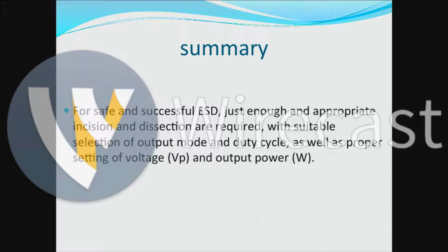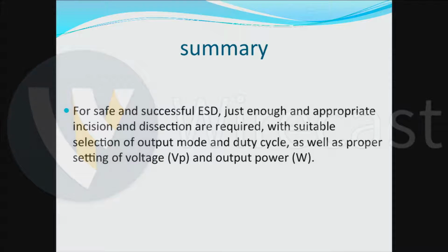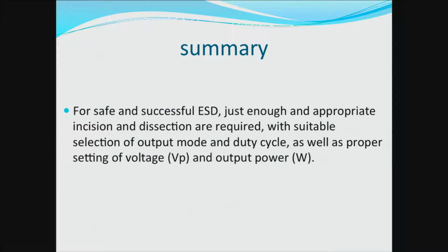coagulation, a needle knife coagulation and a hot biopsy coagulation, the contact surface between the tissue and the knife, if the contact surface area is very small, or the contact surface areas are larger, my setting is coagulation.